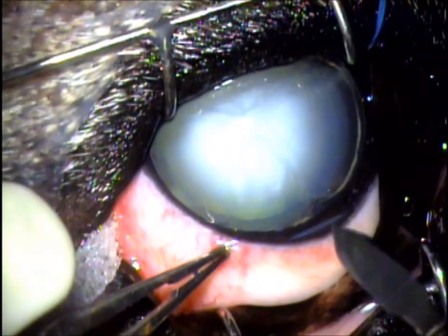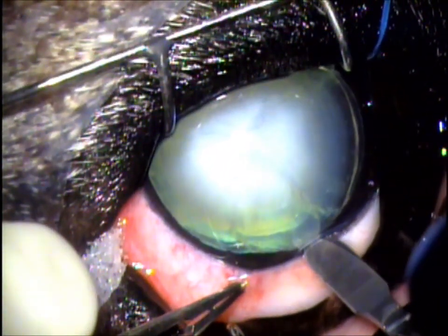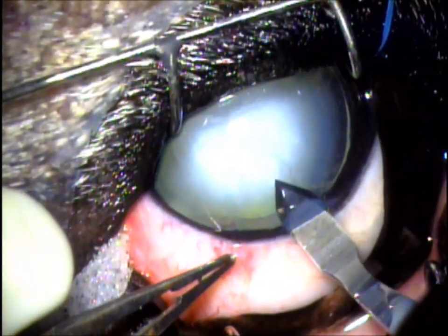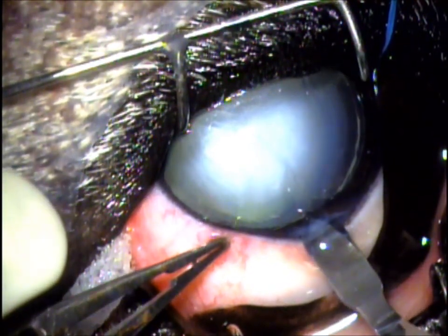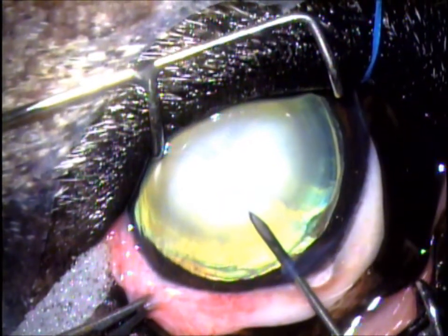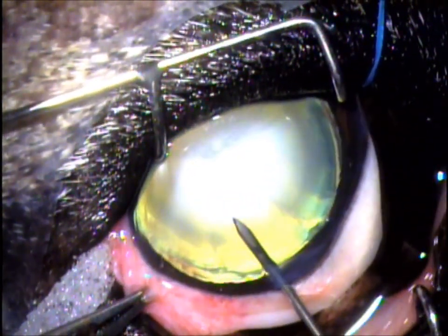We then make what's called a stab incision into the eye with this special blade. You'll see a gentle release of the fluid, or the aqueous humor, from within the eye here. We then inflate the eye with a substance to keep it firm during surgery, before making a stab incision with this needle into the anterior lens capsule.